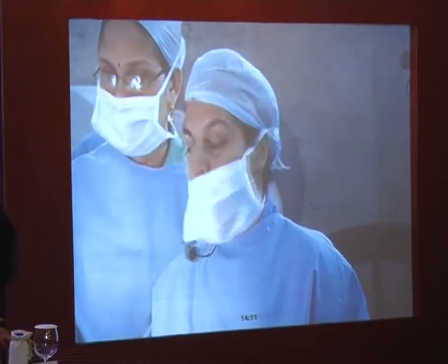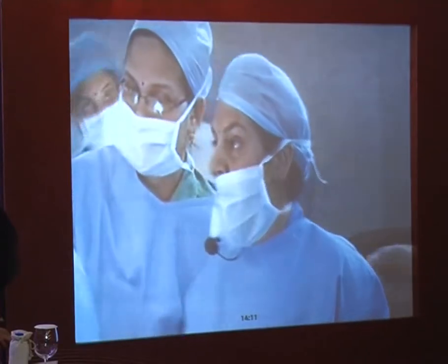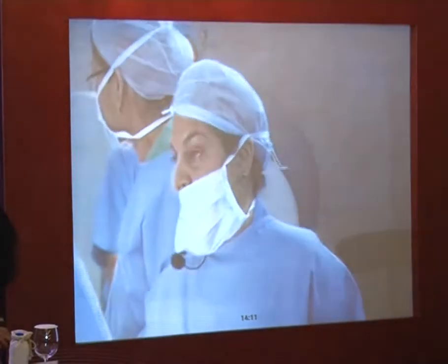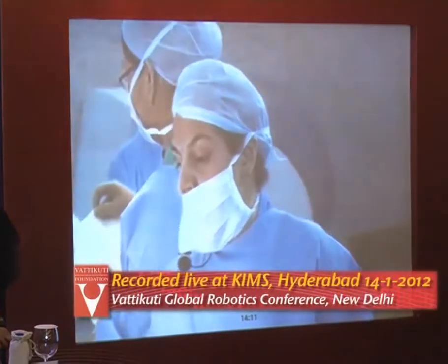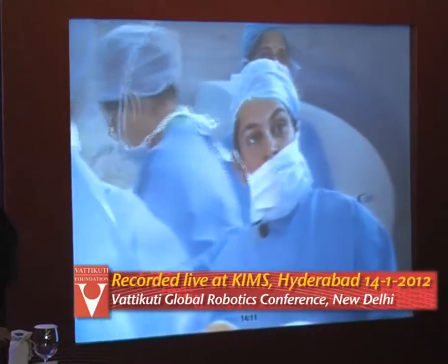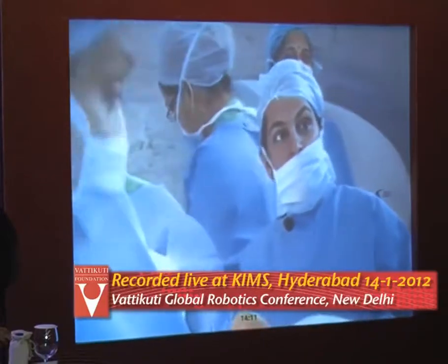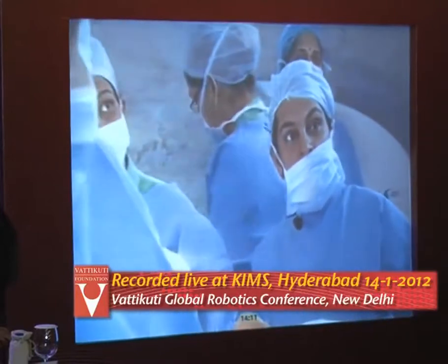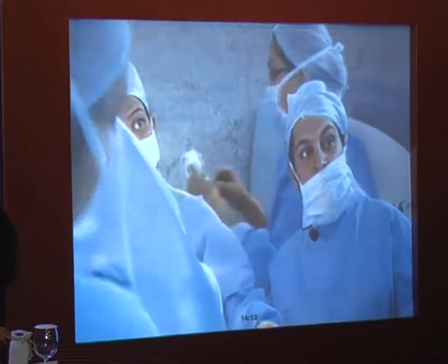Can you show me this? All right, so I'm doing a left-sided docking here. We're using the blunt obturators, which are actually a pain to put in at times because in young women with good healthy fascia, it's very hard to get these things to go through. Once I get the ports in, we'll try to show you with the external camera our configuration for a myomectomy.